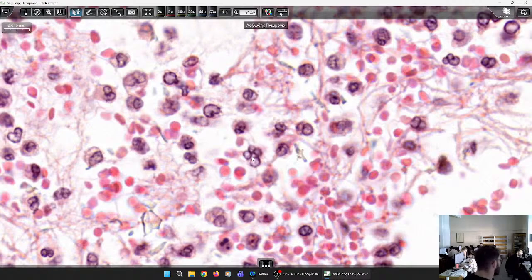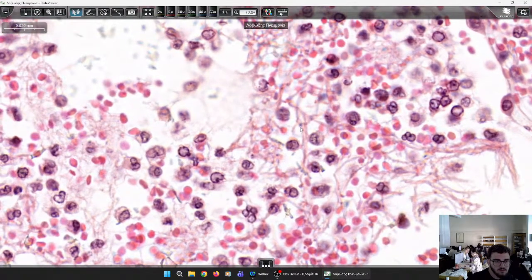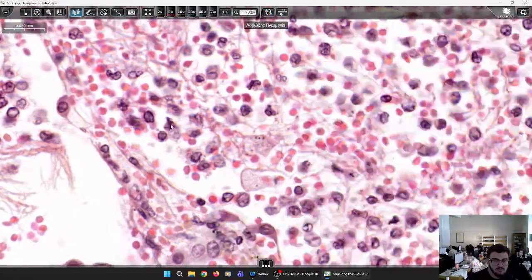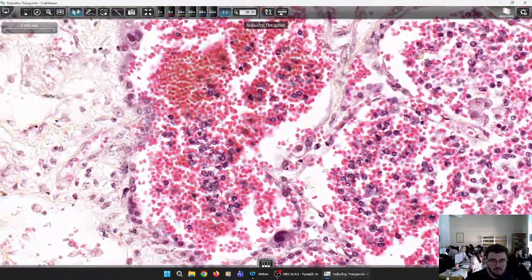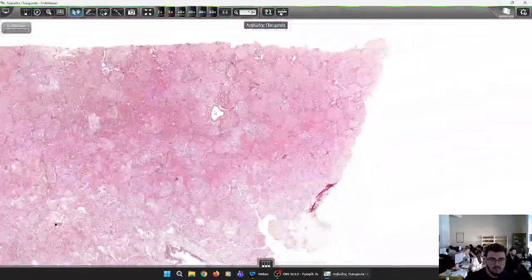And what, yes, please. Because we know also that the lung has elastic fibers. They could be affected by the proteases, the enzymes of the inflammatory cells, and this might predispose to a loss of elasticity later. And this could be related either to atelectasis, where the alveoli collapse, or on the contrary, if the septa break, they cause emphysema. My question was, how can we separate this in the histology? To see what in histology?